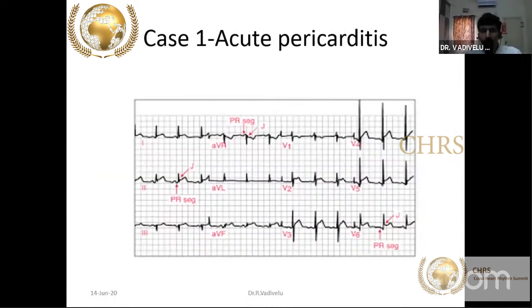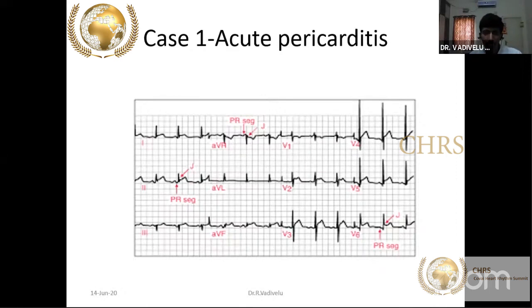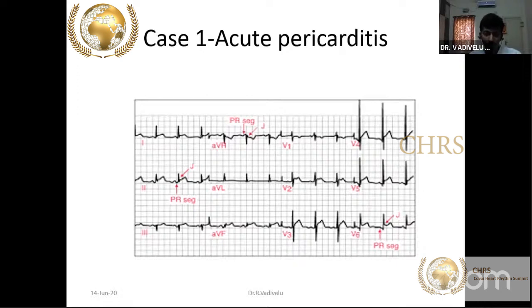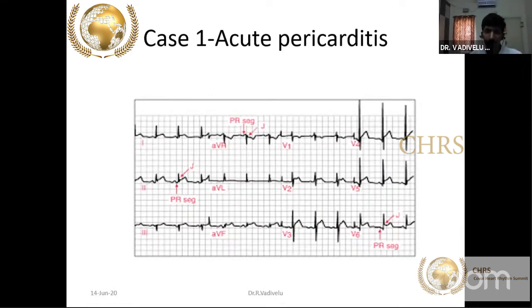Acute pericarditis is differentiated by ST segment elevation in almost all leads except AVR and V1 where there is ST segment depression, and PR segment depression in all leads with PR segment elevation in AVR and V1. This pattern, along with a pericardial rub, confirms pericarditis. Post-operative patients after CABG may develop ST elevation from either pericarditis or graft occlusion — the treatment is completely different, so you must differentiate carefully.